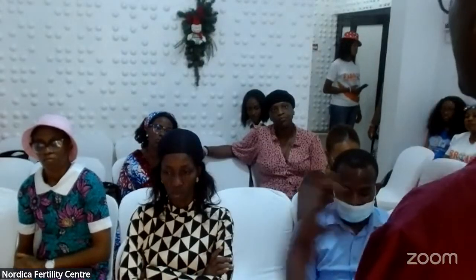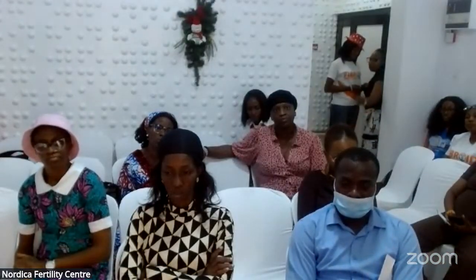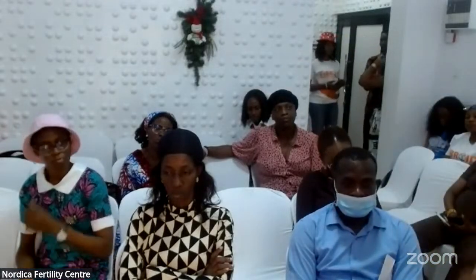Those who have asymptomatic uterine fibroid, because we have people who know they have fibroid, but it's having a psychological effect on them. They just want that fibroid treated. We can do HIFU in those people because with HIFU, it will stop the further growth of the fibroid, rather than it continuing to increase in size.